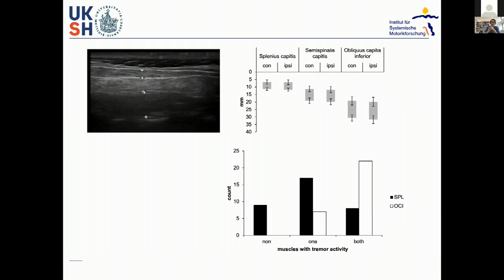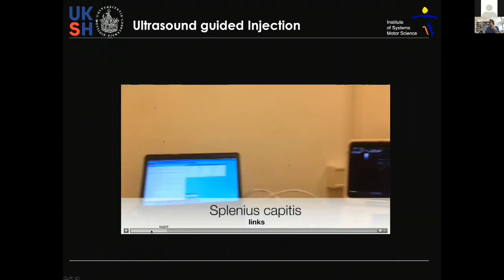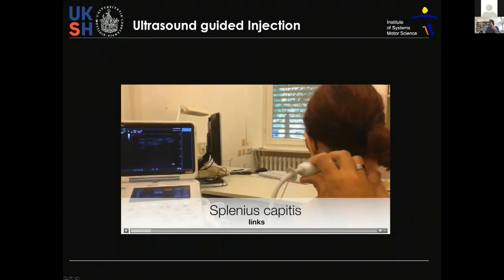Because there's another muscle above, which is the rectus capitis major, and this is a muscle doing a retrocollis. This looks quite similar if you have a much steeper angle of the probe, like maybe 55 degrees. So I'll go back here, speaking about the angle. Go back into this video. Okay, if you have an angle like this, then you see the same picture, but the deepest muscle is a different muscle with a completely different function.